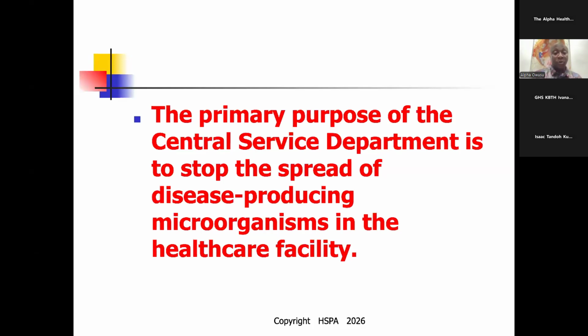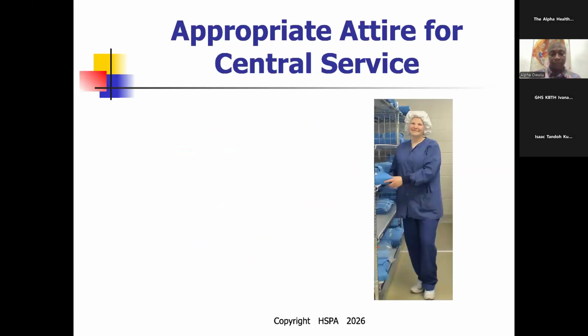And so with the help of the IPC department and Ghana Health Service, now they want to come in terms and come up with these processes. Not that we don't have, we have, but we have not been well structuring it, well documenting it, well enforcing it, well enacting them. So it's very, very important. Again, appropriate attire, like I said, right? You cannot wear your street clothes or bring scrubs from home and then you take it to the sterile processing department. And then when you finish, you take it home, you wash it, and you bring it back. No, time has come that all these scrubs need to be controlled.